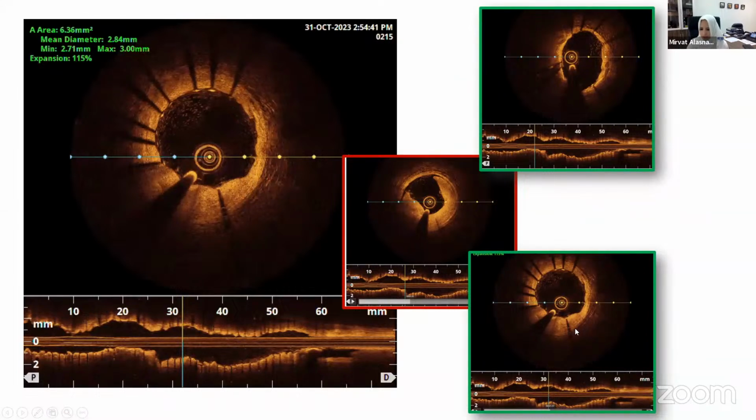And then as you keep going down, you see now more stented segments. It looks beautiful. It's expanded and opposed. But we have a gap between the two stents. We moved the II from RAO-cranial to RAO-caudal. It foreshortened things for us, and we ended up having a very short gap.